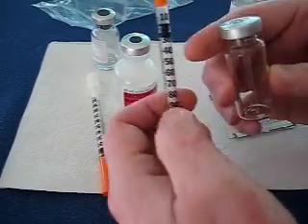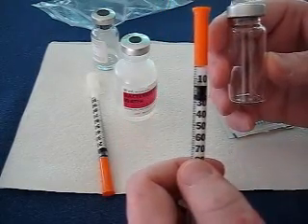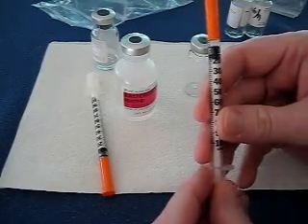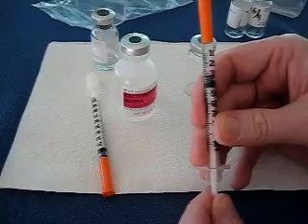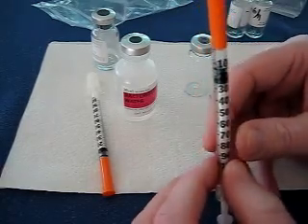If you're going to take out 50 units, you'll need to put in 50 units of atmosphere first. In my case I do 15 units — 1, 5. This needle does 10, 20, 30, 40, and so on, so I would have to go in between the 10 and the 20, and that is 15.